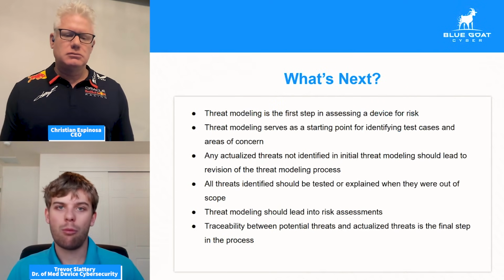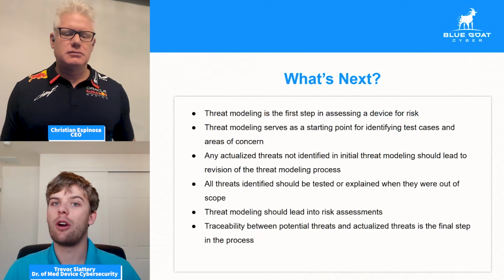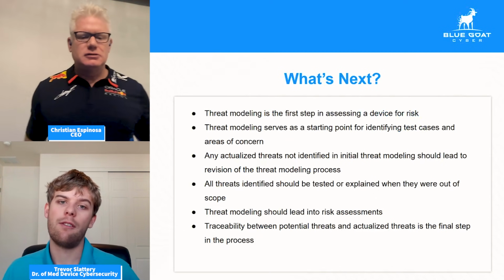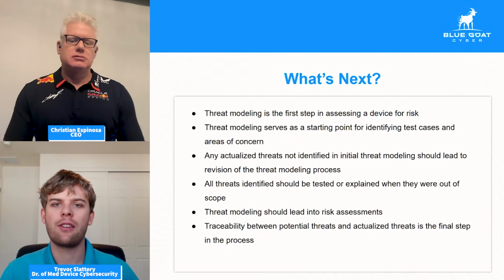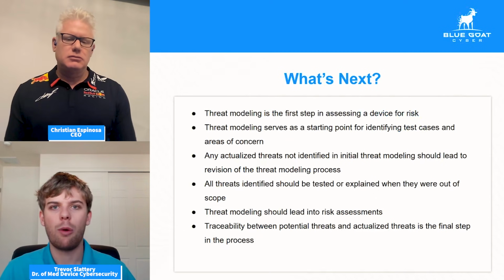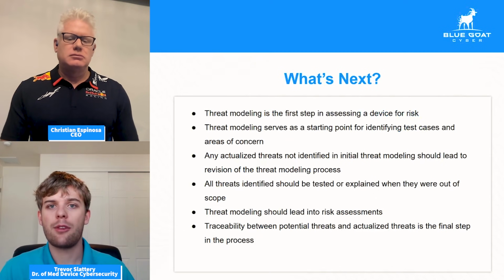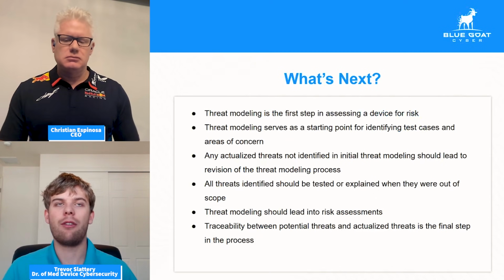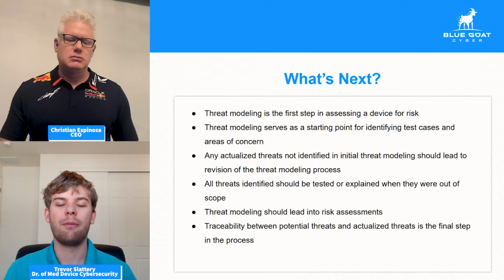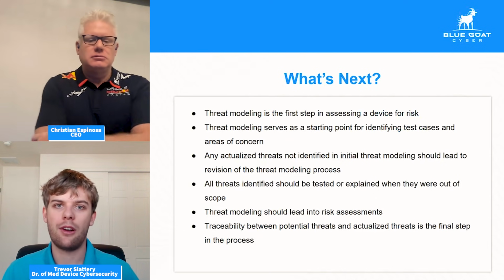All right, what's next? Threat modeling is just one part of a bigger overall risk management system. Threat modeling is important. It should be shifted very far to the left, as far left as possible in risk assessment. This is going to be a conceptual exercise, thinking about what can happen and trying to design mitigations into the system. So oftentimes threat modeling, just from a perspective of the concept of a device, can be extremely helpful so that you can build security in. Security by design is always going to be better than security bolted on after the fact.